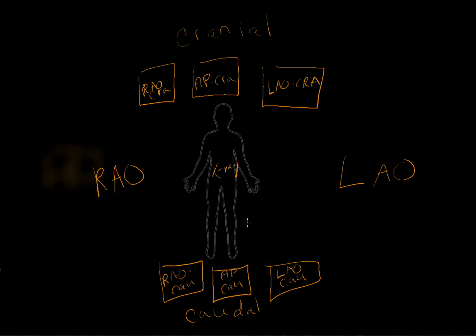You might hear people refer to this one as the spider view. It's the only one of the standard 6 imaging projections that has a nickname, but that's okay. It's just for you to keep in mind in the cath lab. We won't be using that term on this website.